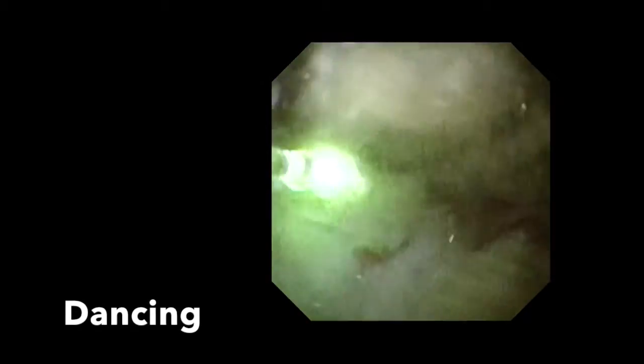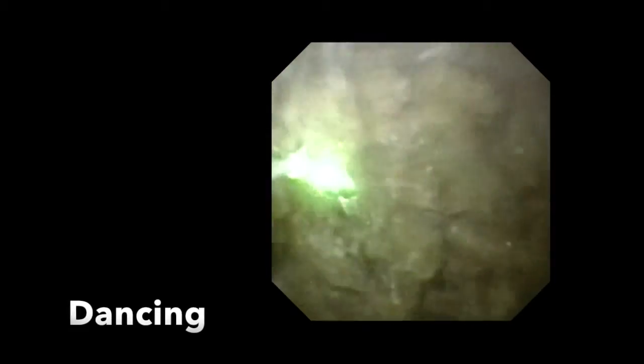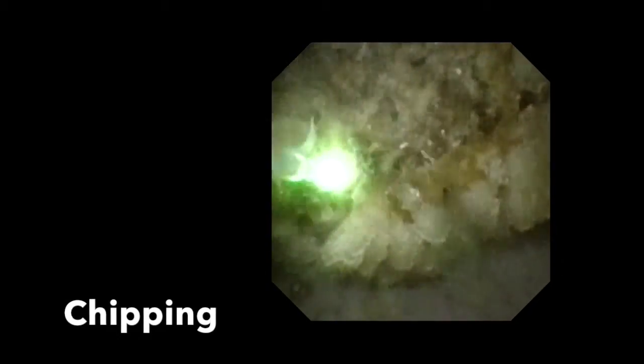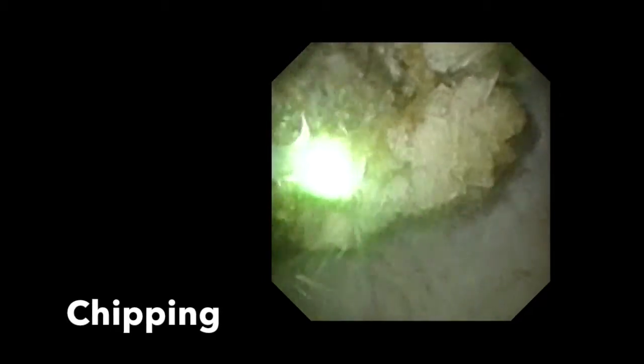We utilize a dancing technique where the tip of the fibre is brushed back and forth across the stone surface so that it is broken down layer by layer. To do this, the scope is advanced and withdrawn rapidly, allowing the fibre to interrogate the surface of the stone, targeting those parts that project forward. The fibre is also directed to the periphery of the stone to allow small fragments to chip off.